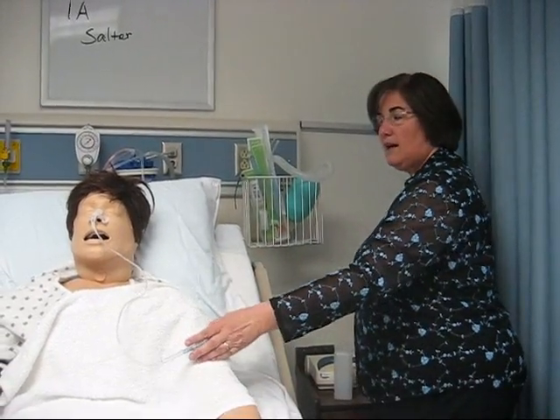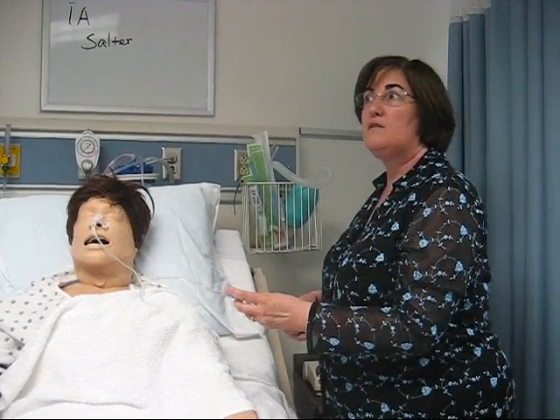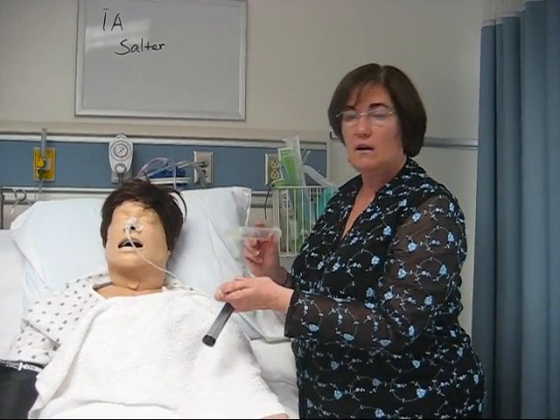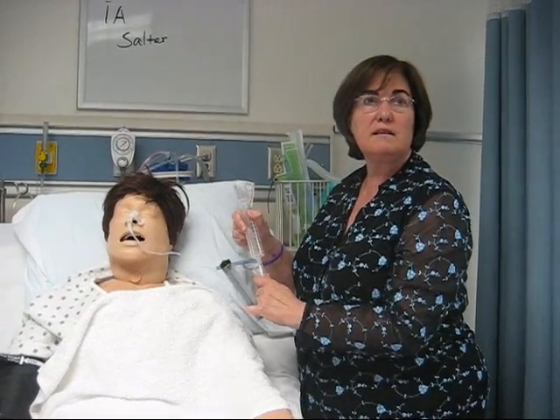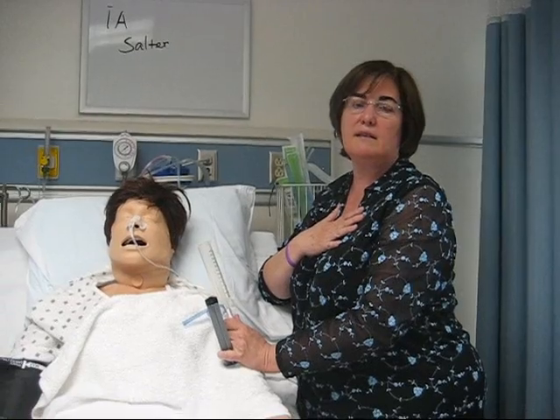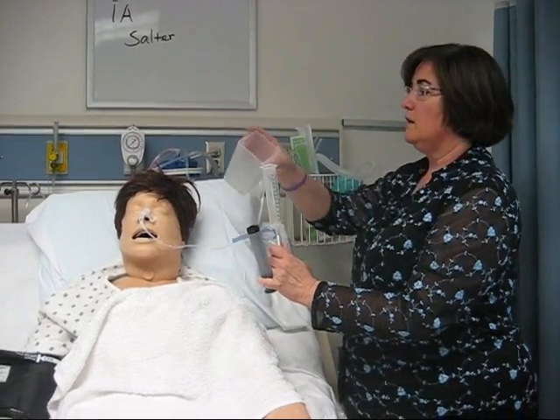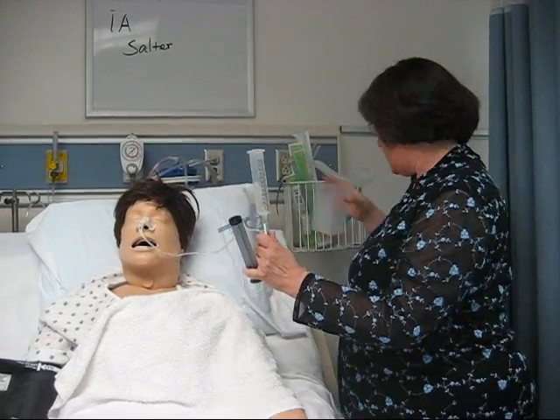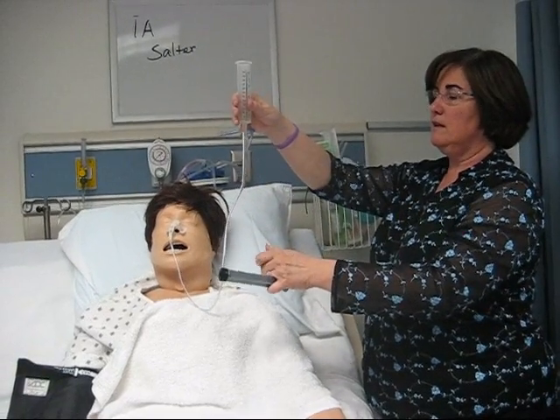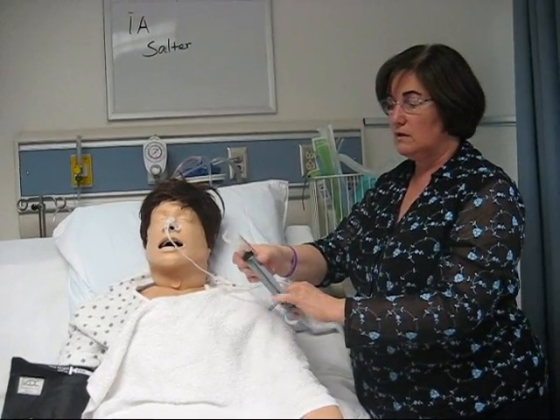So if I put it aside and it's 150, what do I do with it? You keep taking it out? If I'm done, it was 150. Oh, then you mark it. Then I put it back, all right. I need to put it back because the current belief system is that you might be taking out their hydrochloric acid and fluid from their stomach and their nutrition. All right, so you actually could put it back in place and just let it go down by gravity, all right, and put it all back in, and then I would rinse afterwards.